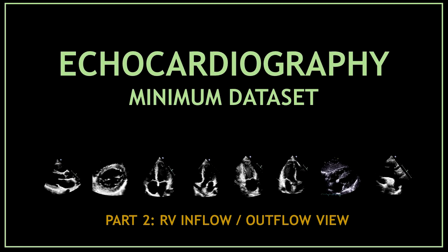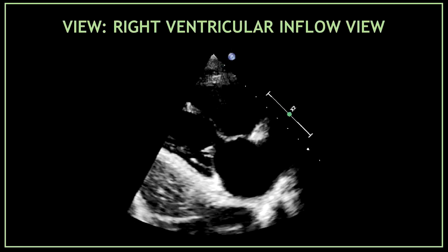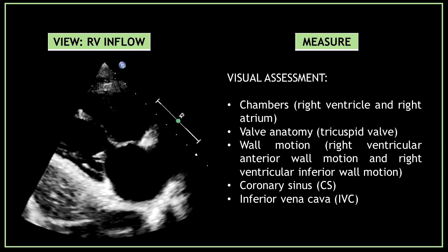So let's start. Let's start with the right ventricular inflow view. First, obtain a right ventricular inflow view and perform a visual assessment of the cardiac chambers. Pay attention to the right ventricle and the right atrium.